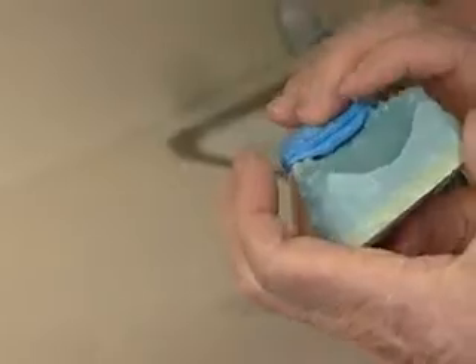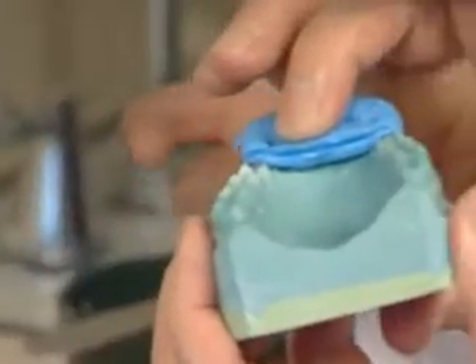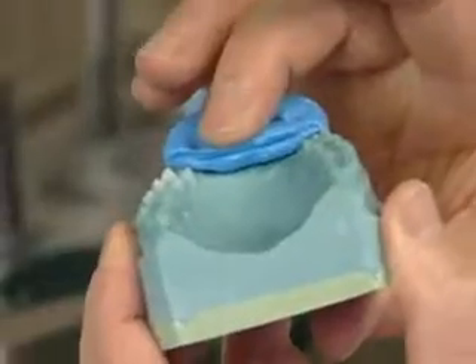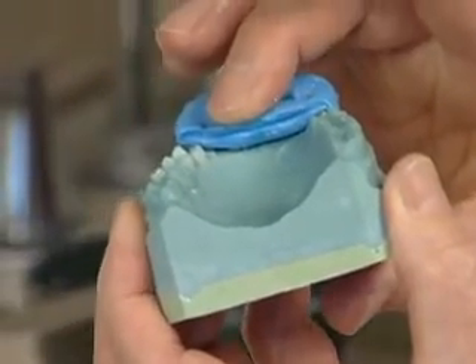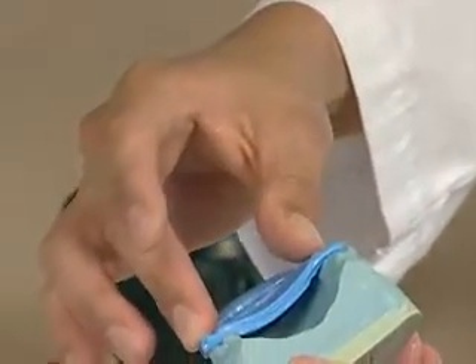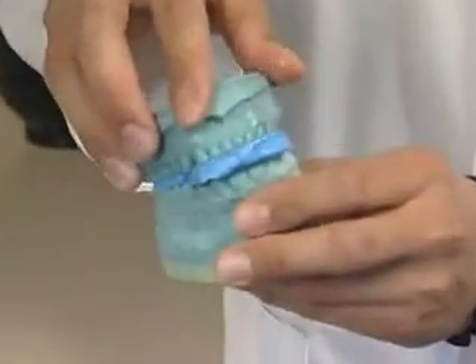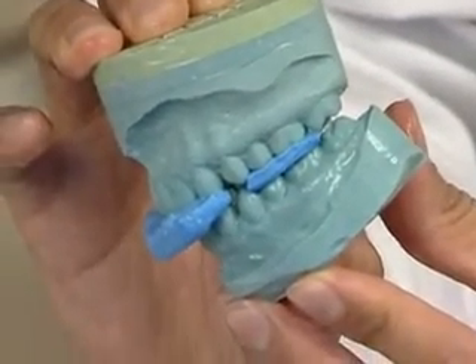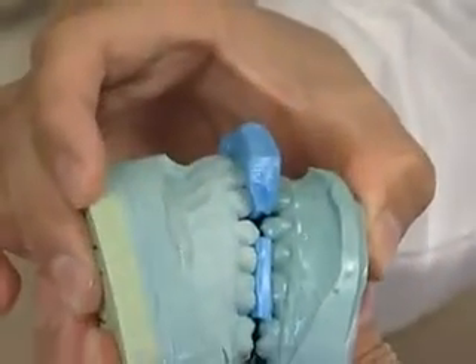He can take his blue wax bites now and put them on the model to make sure they're fitting the model well. What's critical here is to make sure the blue wax is not touching soft tissue anywhere. If there's any doubt, trim away the blue wax so that it's very clearly clearing the soft tissue — I would trim a little bit off the lingual here and here. Then put the upper bite on and do the same thing, looking from the lingual to make sure it's not touching the soft tissue anywhere. Our models fit well into our wax bites, so we can proceed to mount our upper model.